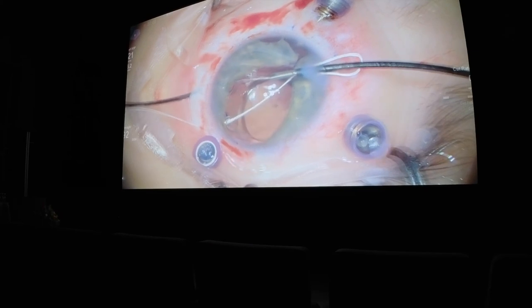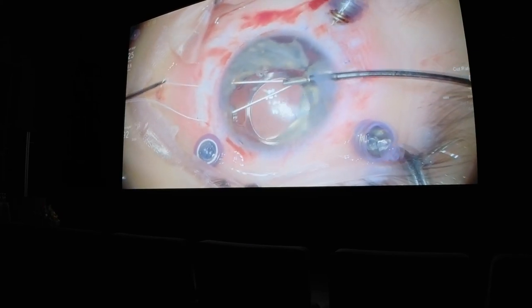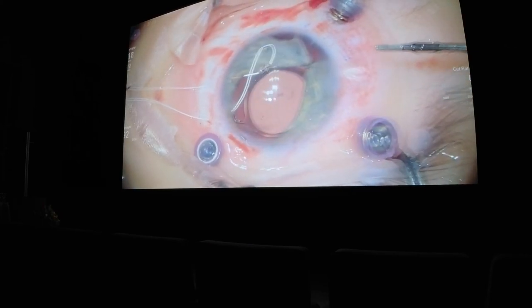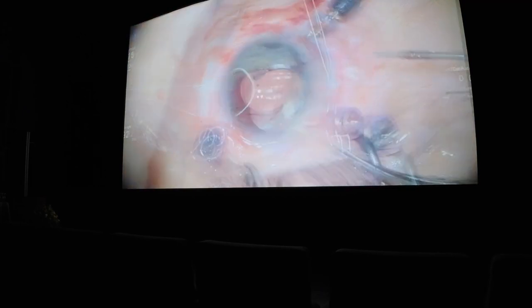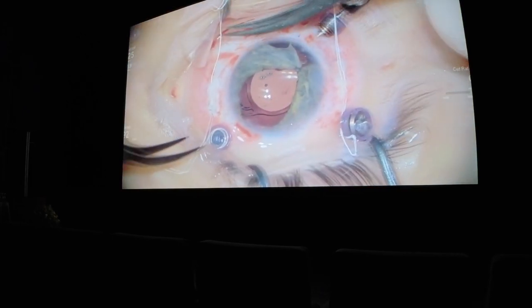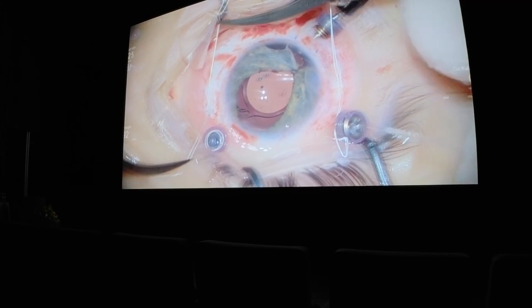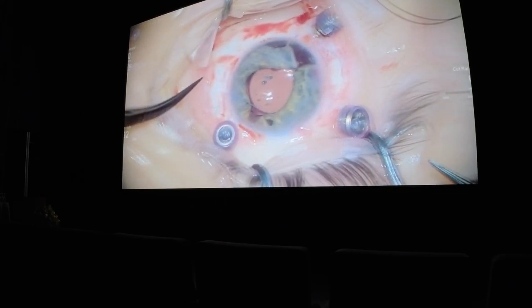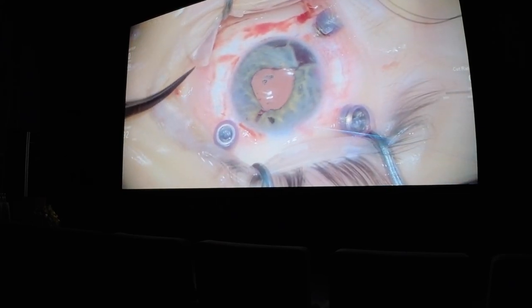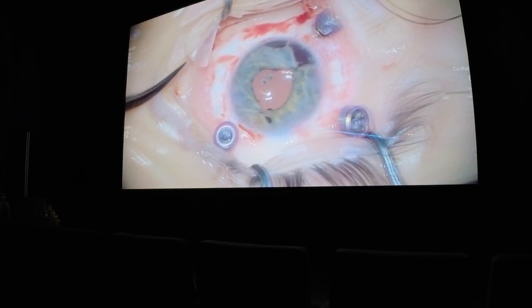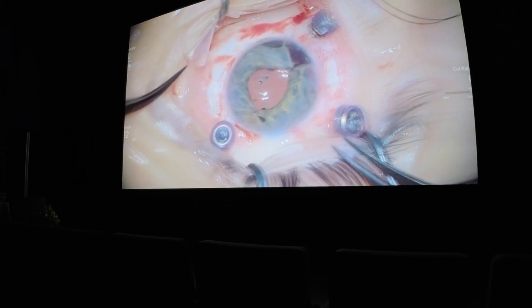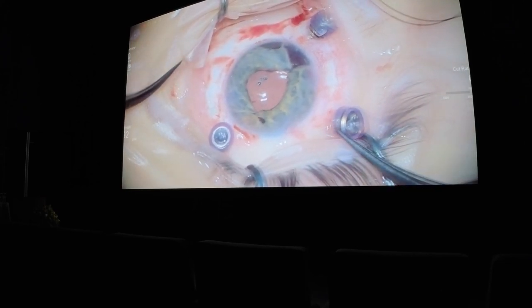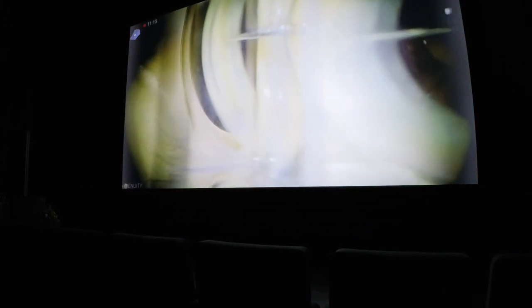I like Gore-Tex sutures because they don't degrade during the years like ProLene — it is a lifetime solution. Remember, this is a 10-year-old boy. With horizontal scleral pockets which will cover the Gore-Tex suture, it will be fixated. This is an additional suture in order to create some shape of the pupil. The eye looks really good after surgery.